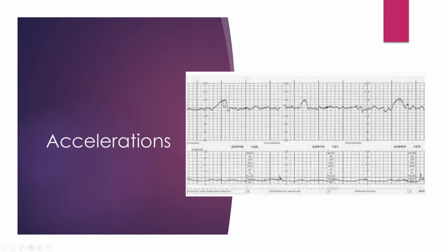So this one definitely does. And then again, right here, this goes all the way up to 180, but it only stays at 180 for a short period of time, but it hits 165, which is right in here, for more than 15 seconds. So again, that's another acceleration. And then over here, this one is the exact same thing. It goes all the way up to even 185, but it hits about 165 and stays there for longer than 15 seconds. So all three of these abrupt increases in the heart rate are considered accelerations. And again, those are very reassuring.